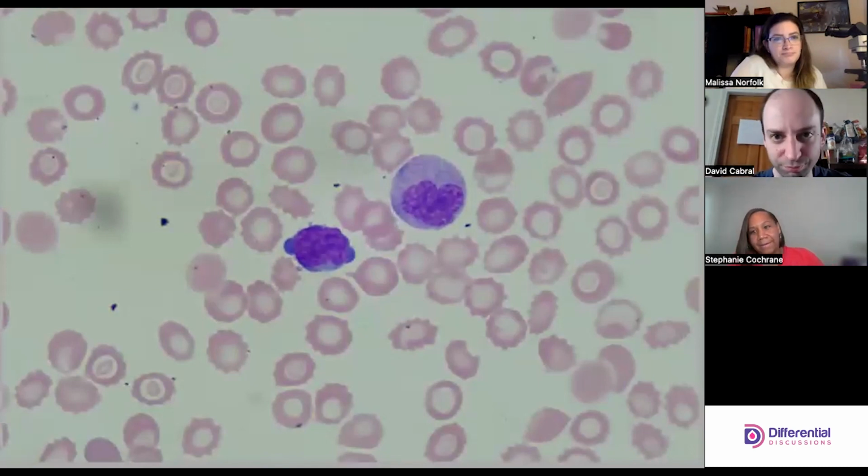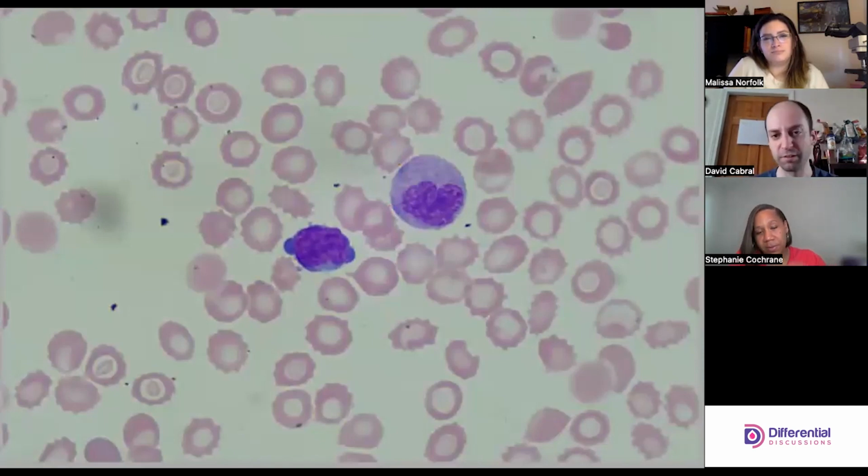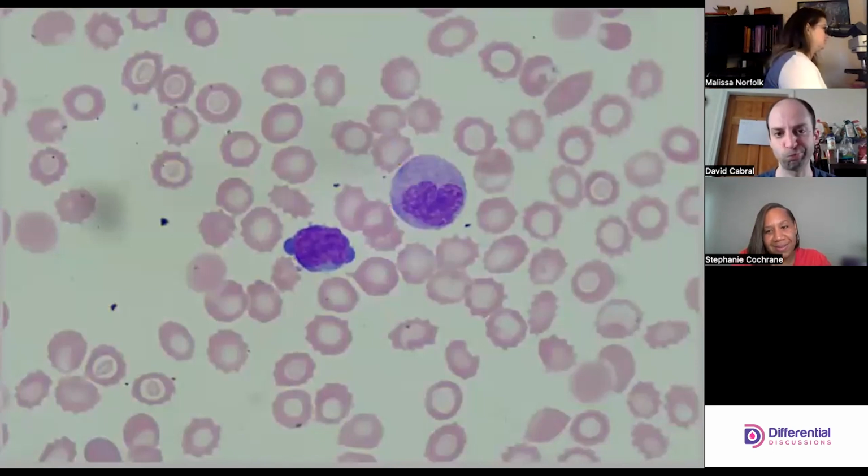I'll tell you what I'm kind of struggling with, at the possibility of looking like a fool. There's what look like Döhle body type staining there, but it kind of looks like a monocyte. But if they're Döhle bodies, it would be neutrophilic. Right. But the cytoplasm is definitely not giving me a neutrophil. So I've got these things kind of fighting each other a little bit. I'll just note it and keep moving, I guess. I need to see more cells. This is a tough one.